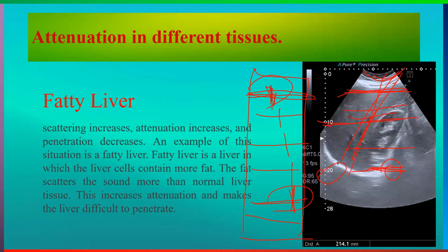Just for example, we are interested in the shadow of a highly attenuating structure, but with the help of artificial intelligence, that shadow which was created due to the high attenuation will also be diminished. So you will have to use the artificial intelligence as well as manual setting, but I will prefer manual setting. All right.